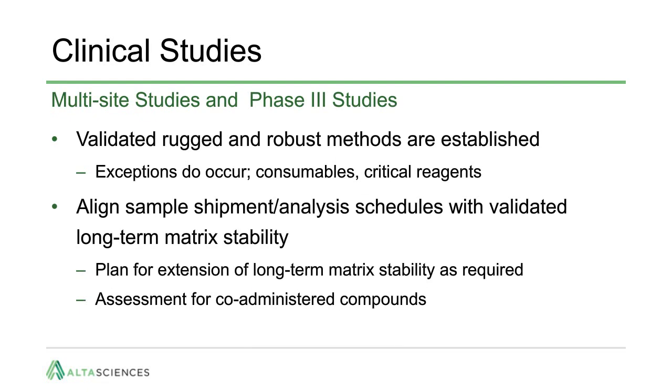Validated, rugged, and robust methods on specific platforms should be available prior to the initiation of the later stage clinical trials. In my experience, challenges to the bioanalysis do arise as a result of consumables and critical reagents. As an example, additional peaks in the chromatogram were traced to a new mat lot used to seal the injection plate. This was finally attributed to a mat manufacturing process change after some investigation.